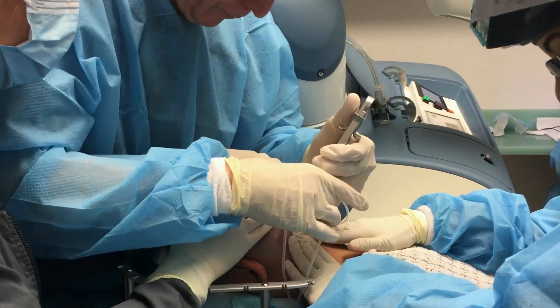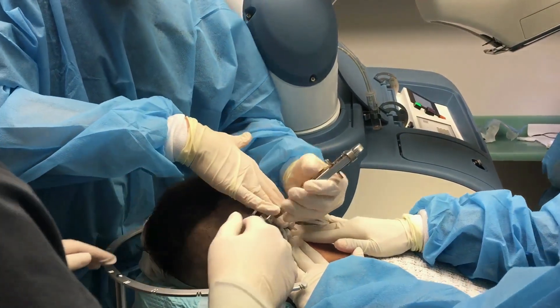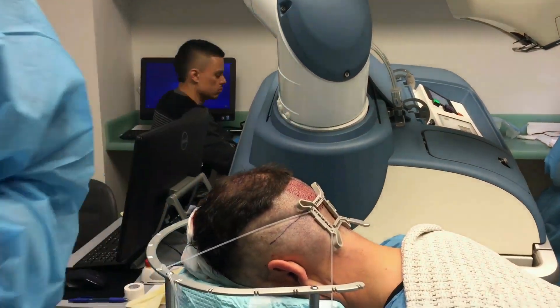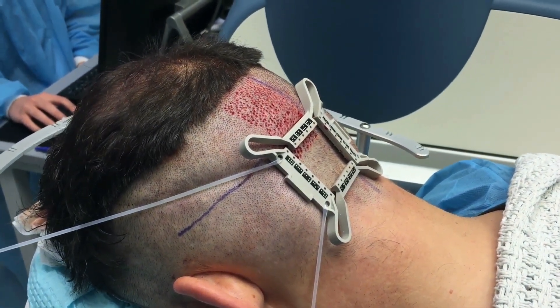Now we're going down to the fourth grid — this is the second level below the occipital protuberance. Here we're going to do some feathering of the edges. The spacing is increased to 2 millimeters from 1.7, and we use a one-pass technique instead of a two-pass. You can see that it's significantly below the occipital protuberance.